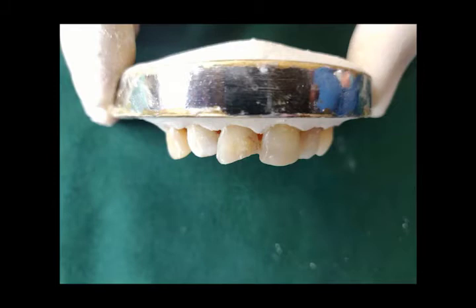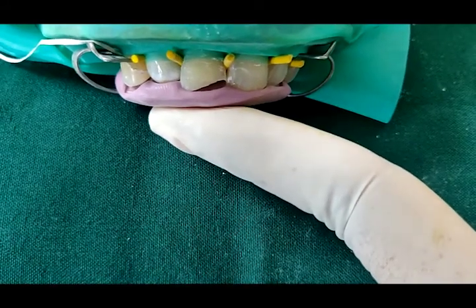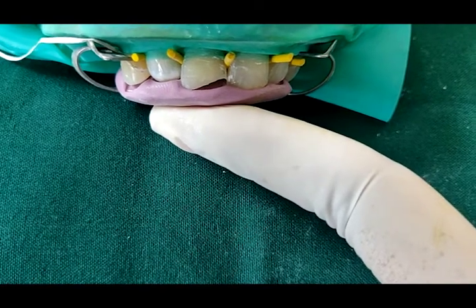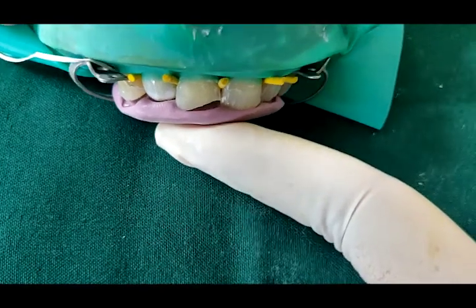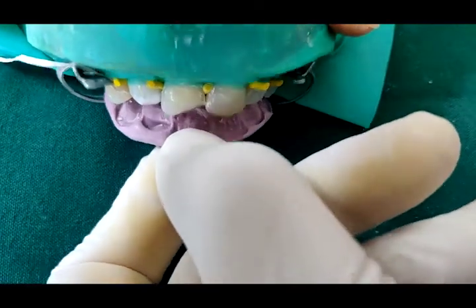In this video, we will be showing the preparation of a Class 4 mesial cavity on tooth 1-1. Prior to the start of the preparation, a putty index is made. The important point here is to make the putty index flush with the incisal edge and not rolling over the incisal edge.